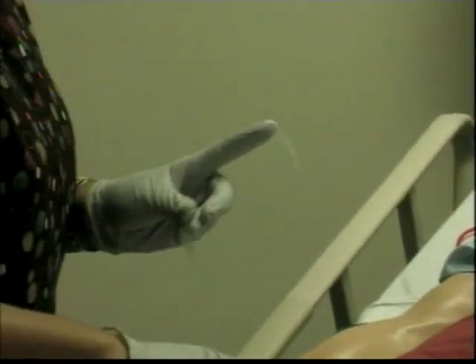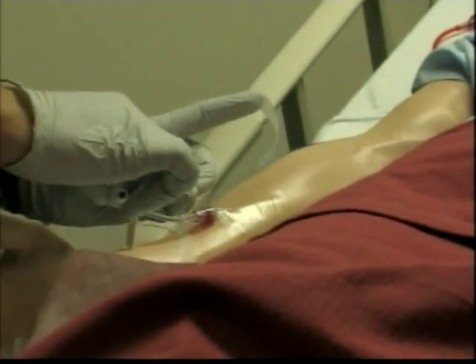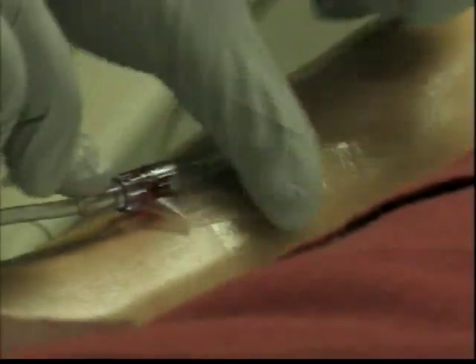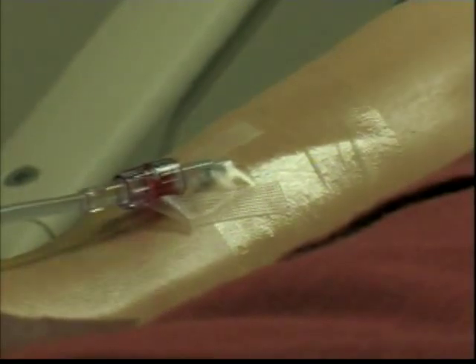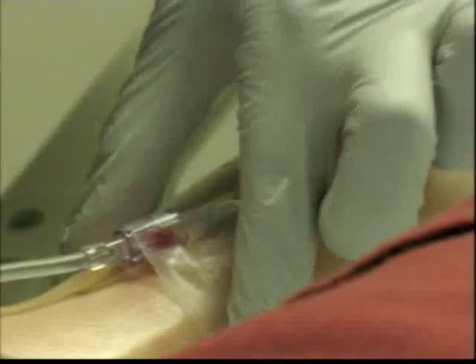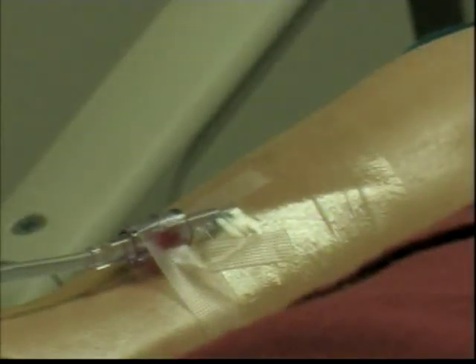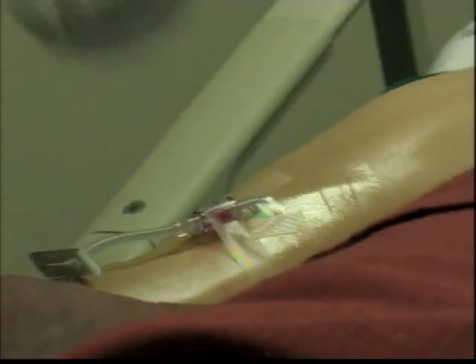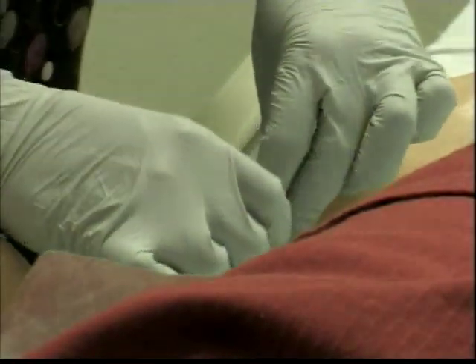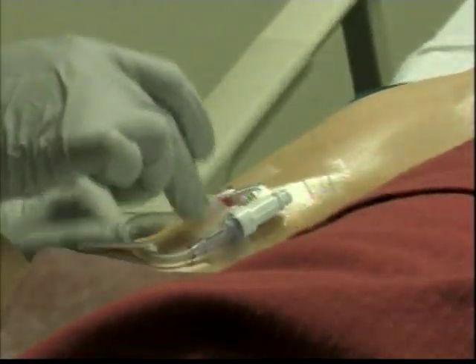So now with this part, you're going to get the sticky part up. You're going to go right underneath it, and you're going to catch the extension, and you're going to create a U. You're going to fold it and up, fold it and up. You see how I created a U in there? And with this extra piece, then you're going to cover the contour of the extension and anchor it in place. This is one of many ways that you can tape the IV, and we'll discuss the rest of them in lab. Then you're going to get another longer piece, and you want to make sure that you loop your extension and that you tape it in place.